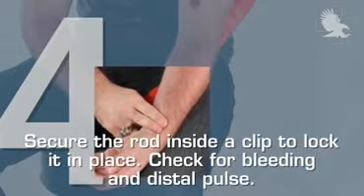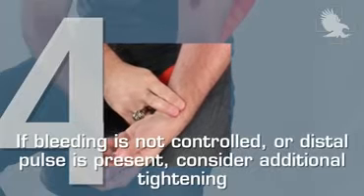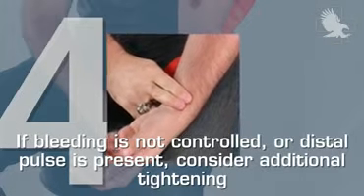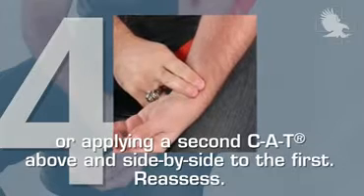Step 4. Secure the rod inside a clip and lock it into place. Check for bleeding and distal pulse. If bleeding is not controlled or distal pulse is present, consider additional tightening or applying a second CAT above and side by side to the first. Re-assess.